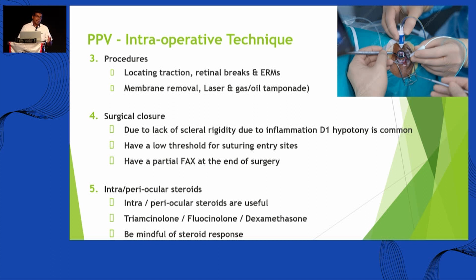Obviously, these can be infective cases, so you discuss with your uveitis specialist and the other team, and you plan the surgery. You don't want an infective case at the beginning of your list. Make sure that it's at the end of the list, or you have it in a different theater, and make sure that, as we reuse our cutters, sometimes you will need to discard these cutters. Make sure that you tell the staff to discard the cutters if it's an infective case that you have handled.